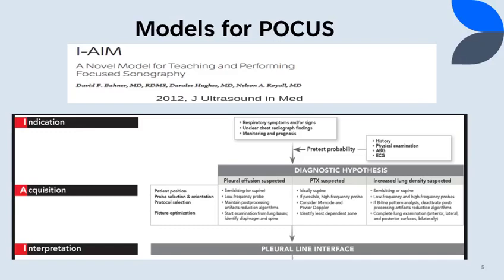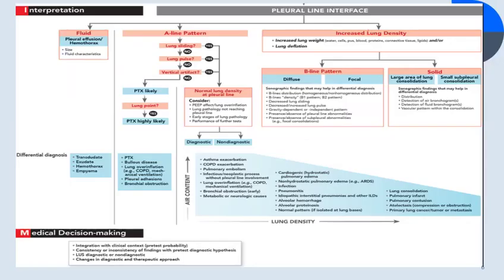And then your M is for your medical decision making. This is just a continuity from the previous I-AIM model. So again, it looks at the interpretation. You interpret according to the protocol that's being provided. At this instance, we are looking at the BLUE protocol, which is basically your basic lung ultrasound in emergency settings protocol. And then in terms of your medical decision, you have to decide if you either intubate the patient, are you putting up an intercostal drain or not, and what type of diagnosis are you actually giving this patient.